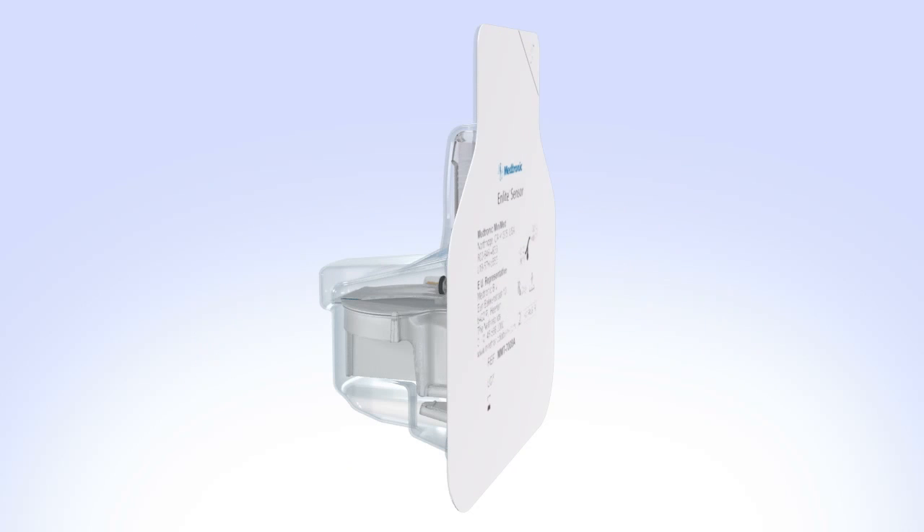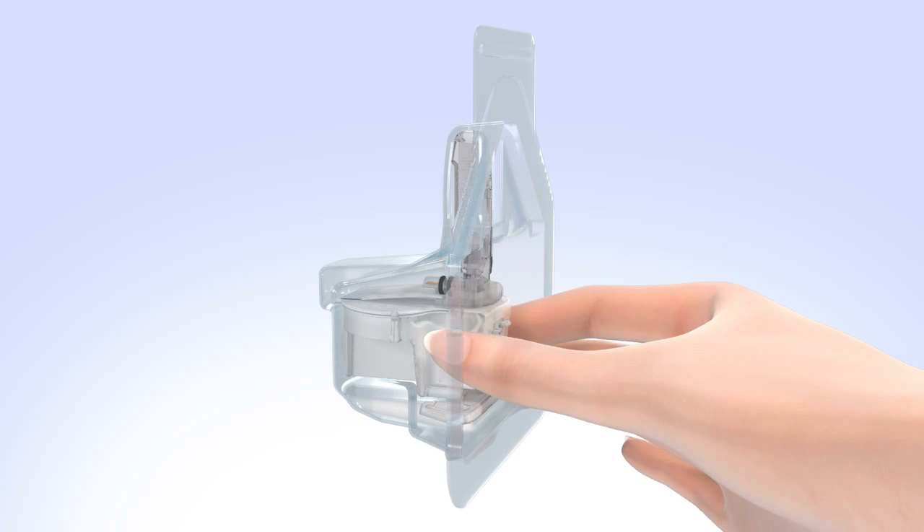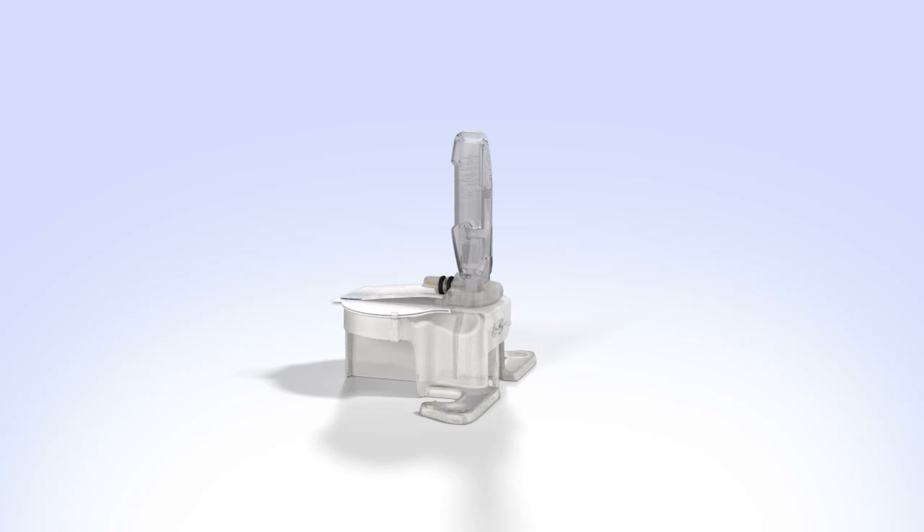Open the N-Lite glucose sensor package. Remove the sensor from the package by holding the plastic pedestal. Do not hold it by the sensor or needle housing, as this could damage the sensor. Place the sensor with pedestal on a clean flat surface, such as a table.